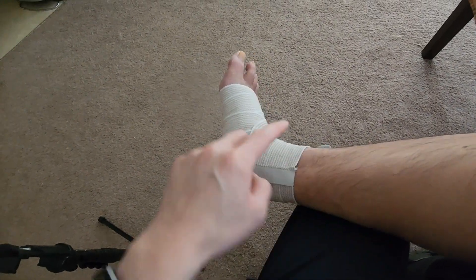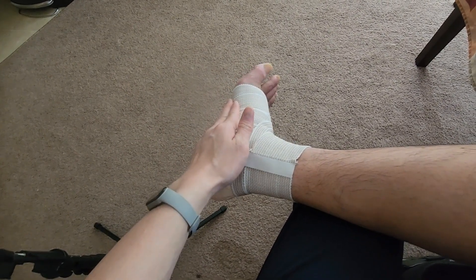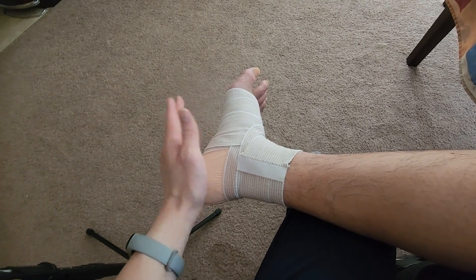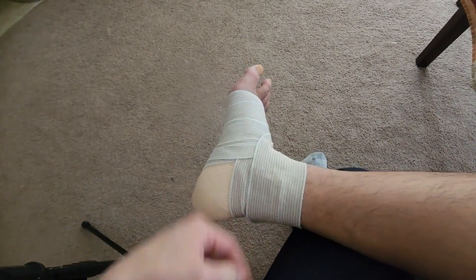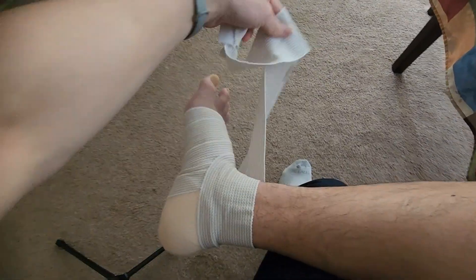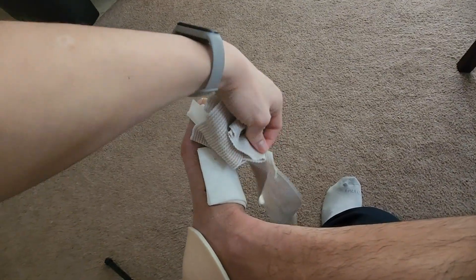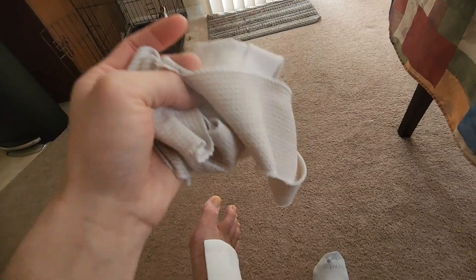For this next part of the video, I'll show the open wound I had after ankle surgery to fix my dislocated and fractured foot. If you get queasy by blood or graphic images, I recommend ending the video here. Otherwise, I'm going to go ahead and unwrap my bandage. You can see there's some blood built up here. Always have a bin nearby to dispose of used dressings and infectious materials to keep things sanitary.